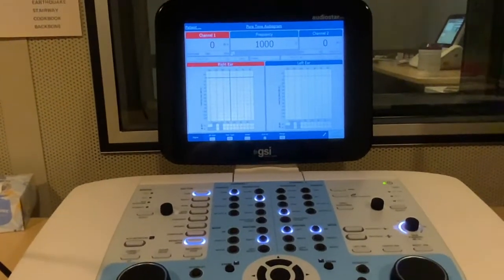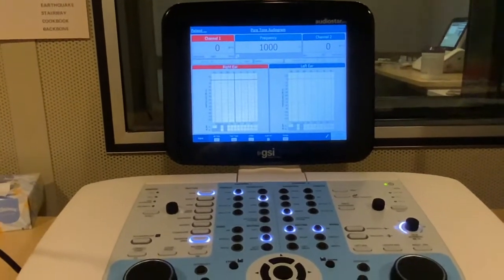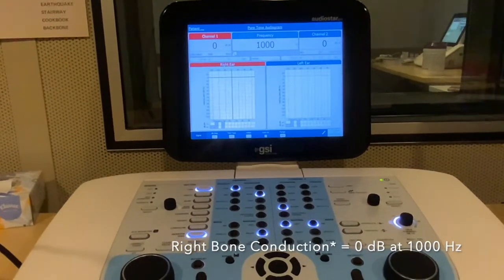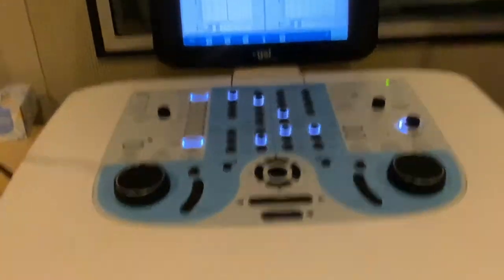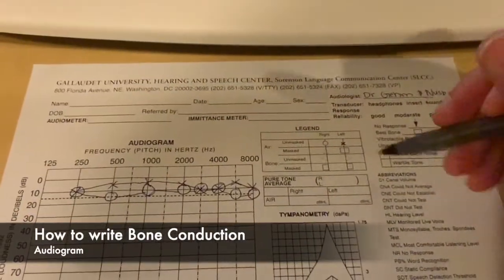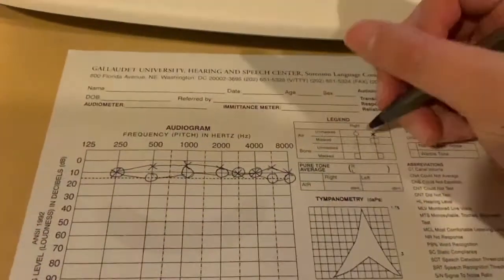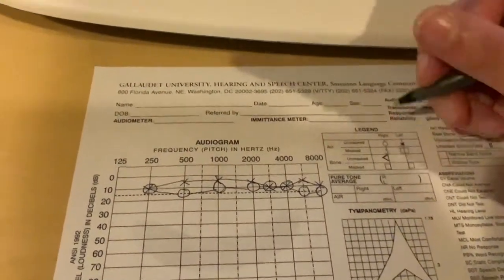Got a response at zero. And so more than 50% of the time when we presented at zero, Emily gave us a response, so we can mark the right unmasked bone conduction threshold at 1000 hertz at 0 dB. So let's look at our symbols. It might be a little hard to see, but the right unmasked bone threshold is going to look like this, an arrow pointing in.